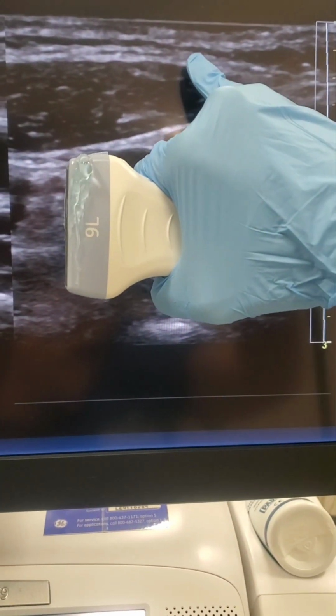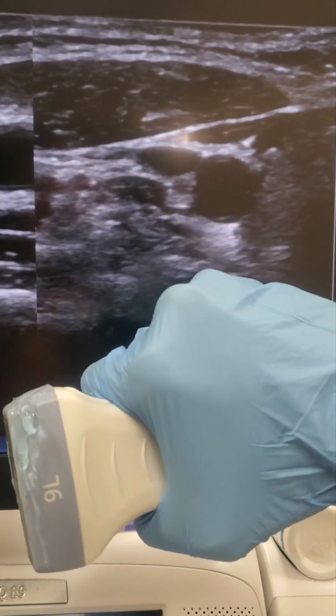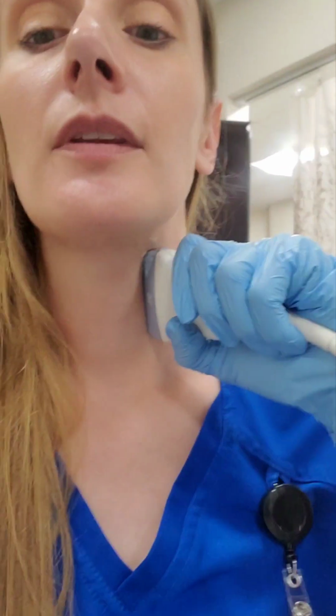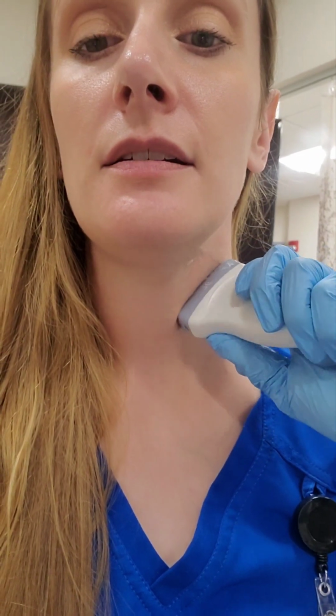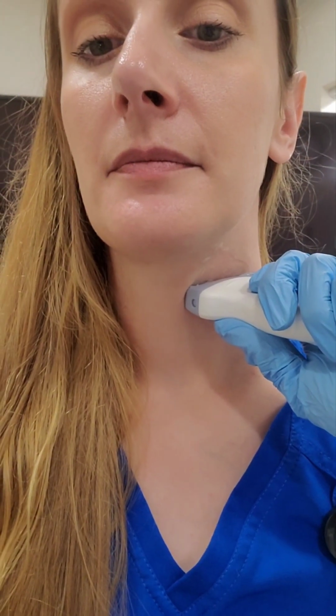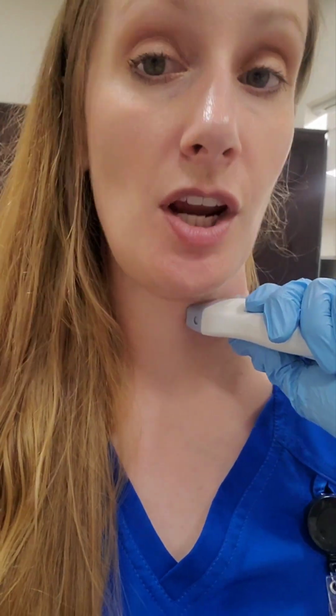And again, it's still the transducer face in a way. We're still going from superficial to deep. In fact, you watch my movement, that doesn't change. I'm long to the carotid, short, transverse to the carotid. But that transducer face, I'm literally turning in that same spot. It doesn't change. Okay?